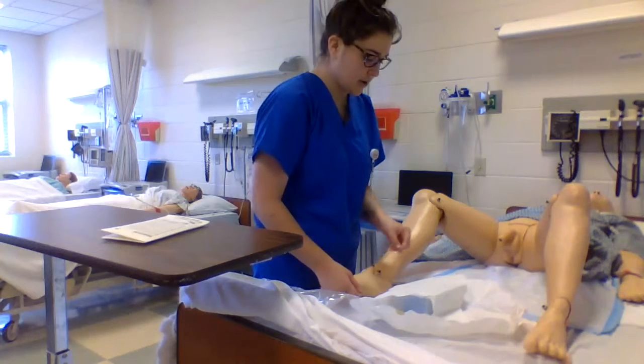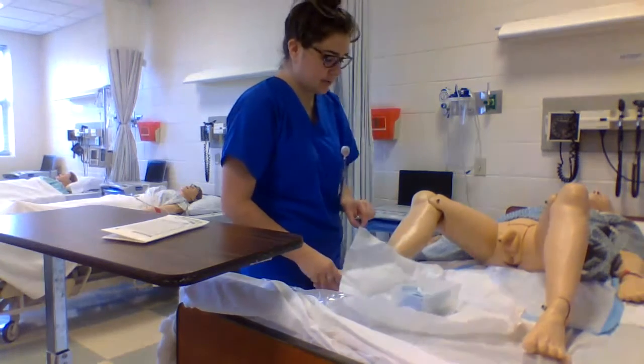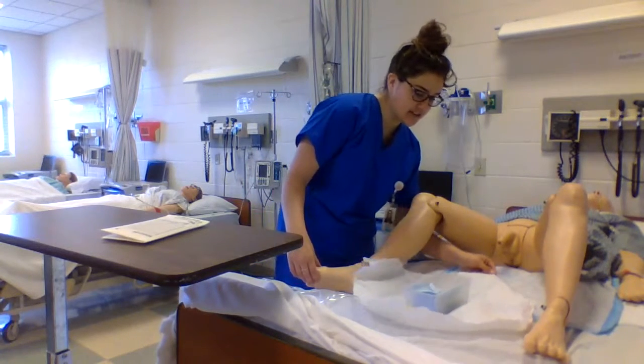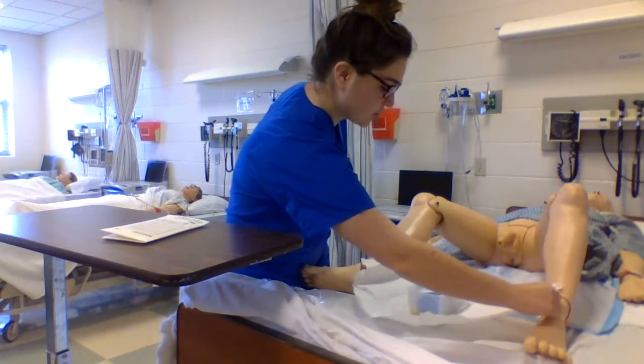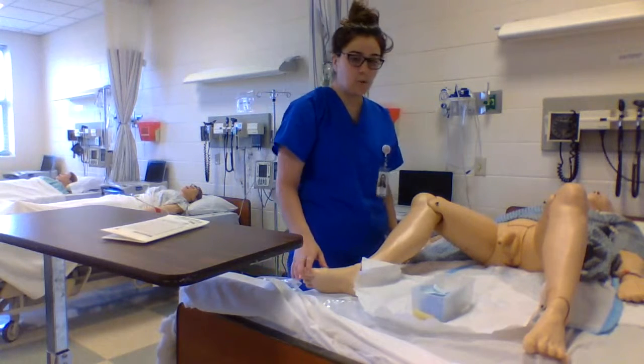I'm going to pull it away from me, make sure that if I need to adjust it, I can. I still have a 1-inch border that I can adjust around. Make sure I don't cross over my sterile field, though. So I've got it adjusted where I want it.